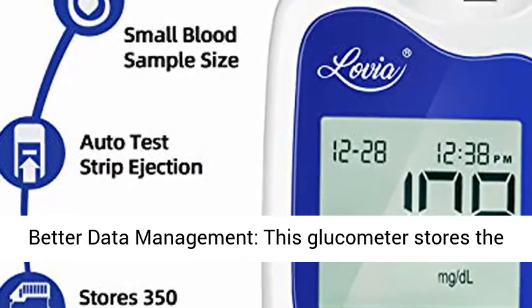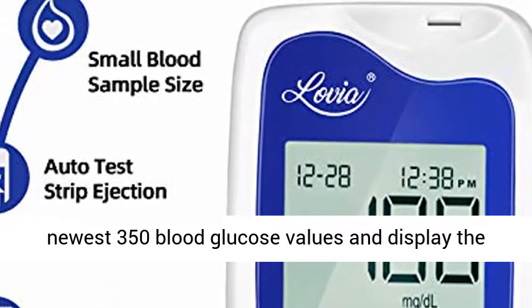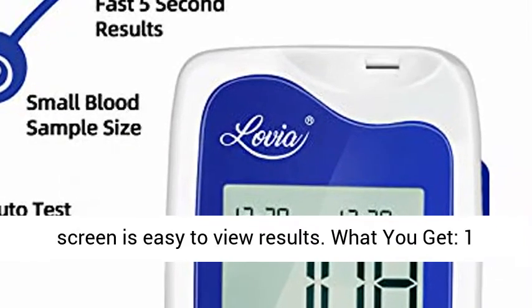Better data management: this glucometer stores the newest 350 blood glucose values and displays continuous 14- and 30-day averages. It will help you track and manage your blood glucose. The large LCD screen makes results easy to view.